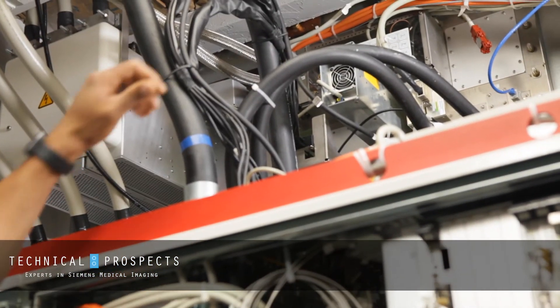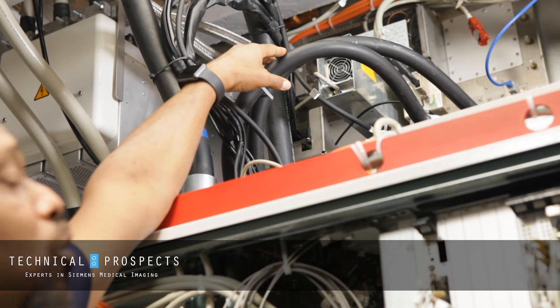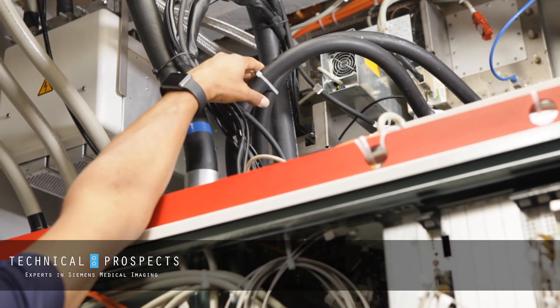Now we'll go above the cabinet and we'll check here as well. We have water going to our TASS as well as going out to our gradient coil. If we see any signs of a leak, it's really critical up here because we are above our power electronics.